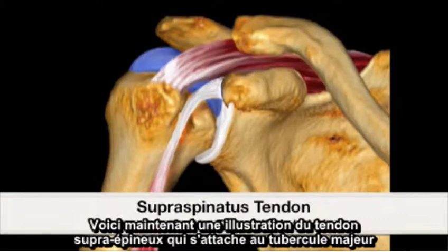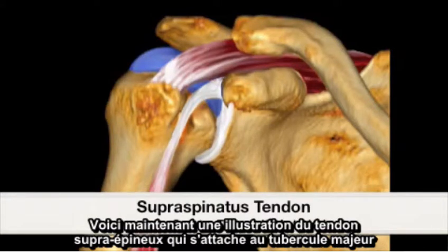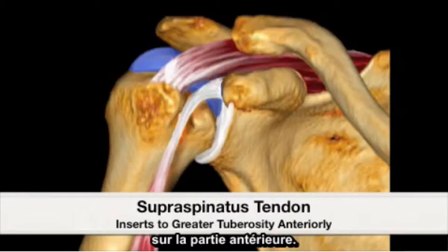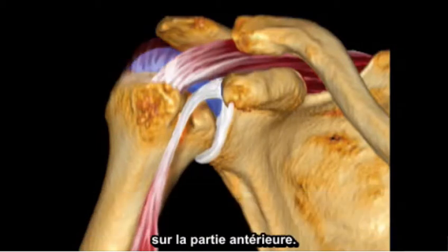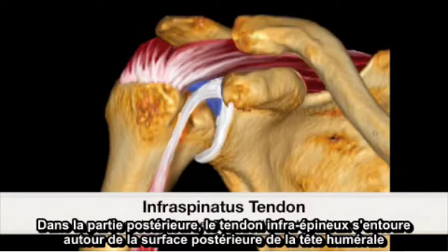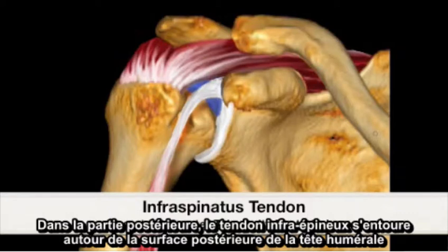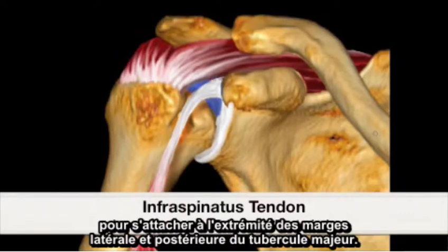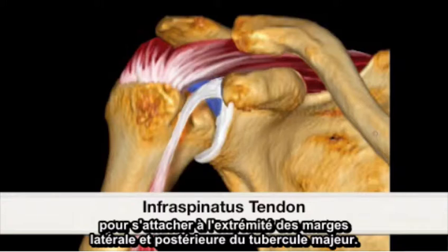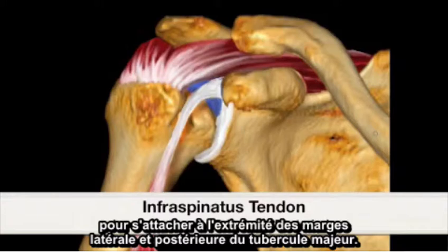Illustrated next is the supraspinatus tendon as it attaches to the greater tuberosity at the anterior portion. Posteriorly, the infraspinatus tendon wraps around the posterior surface of the humeral head to attach to the remainder of the greater tuberosity's lateral and posterior margins.